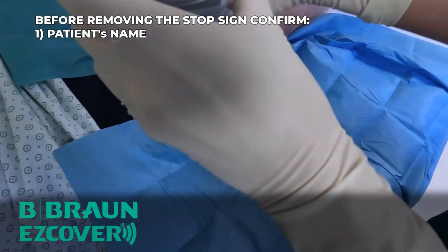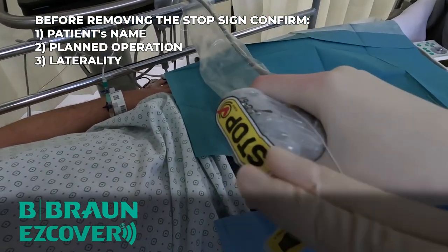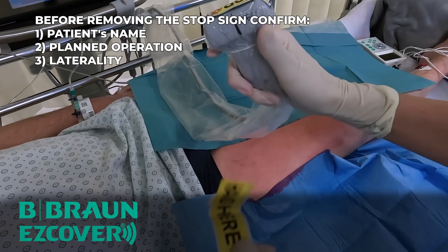You will also see the use of the easy cover probe cover with a stop sign to remind practitioners to perform the final checklist at the point of care to prevent wrong procedure on a wrong patient or wrong side.